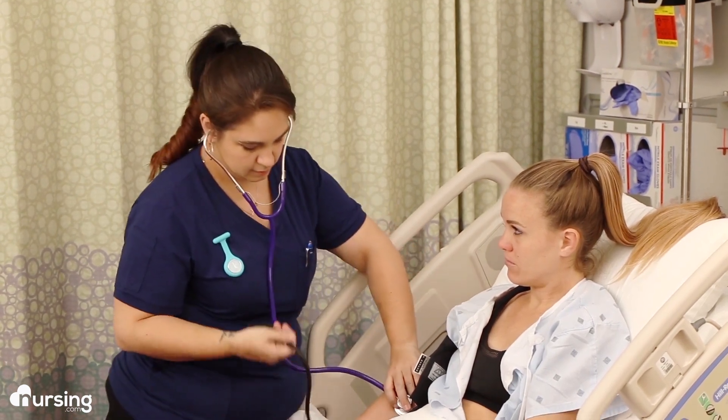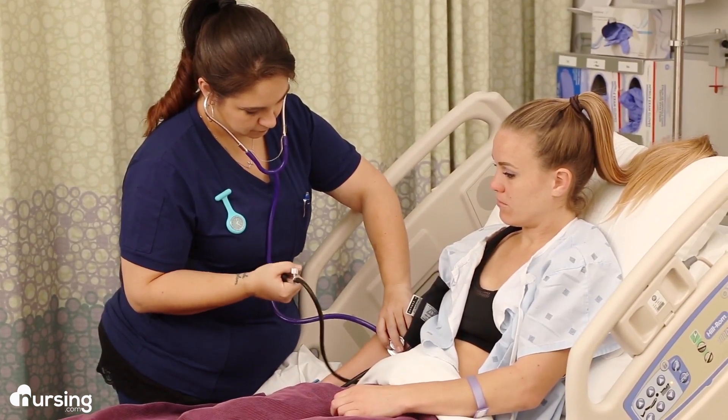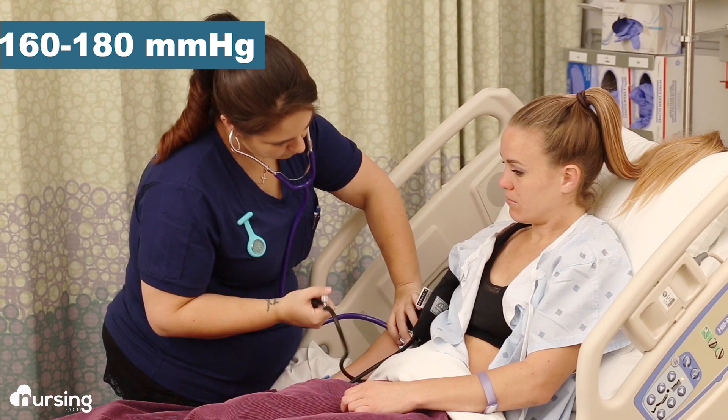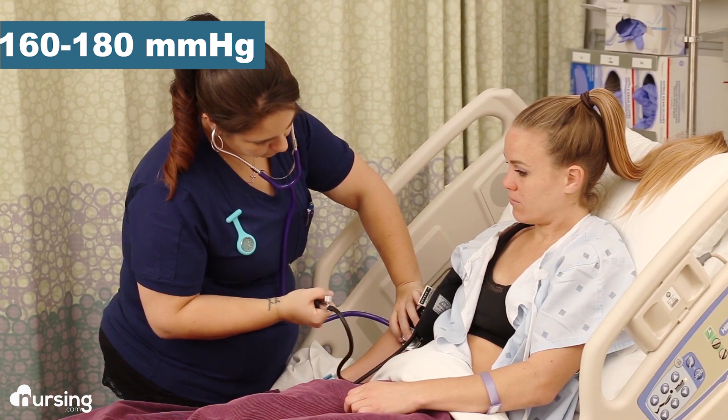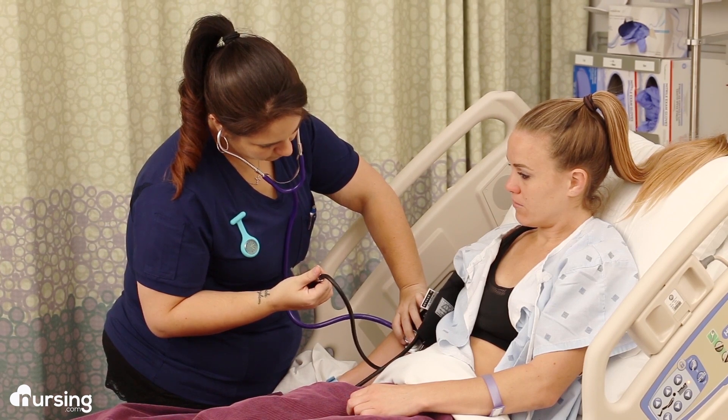Then inflate the cuff by squeezing the bulb until you can't hear the brachial pulse anymore, which on average is usually between 160 and 180 millimeters of mercury. Or you can inflate to about 30 to 40 millimeters of mercury above the patient's baseline blood pressure if you know it.